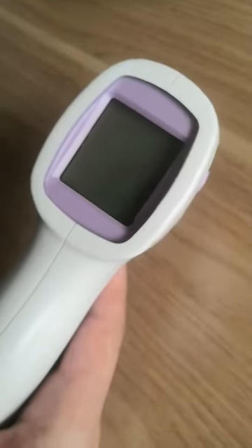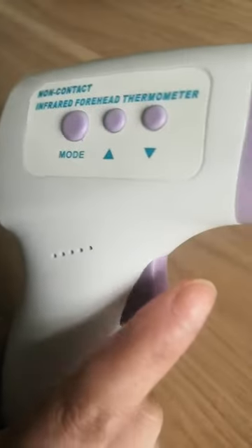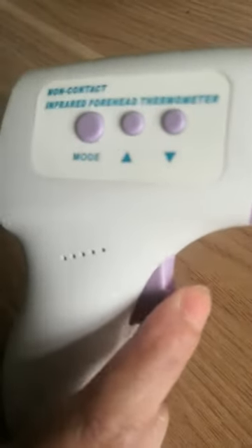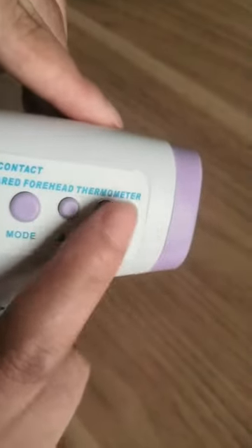Hi friends, now we will show you how to change our thermometer mode. First, press this button. Here is the LCD screen. Now press the mode button and you will see F1, then use this button to scroll down.